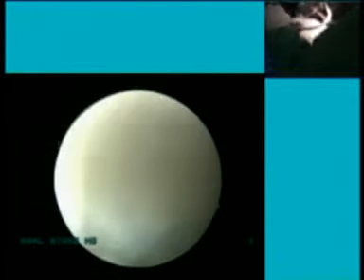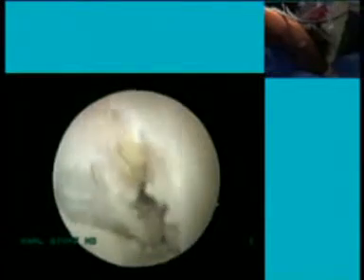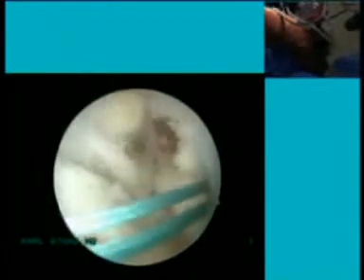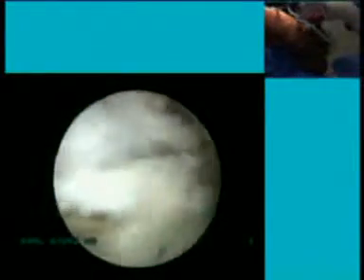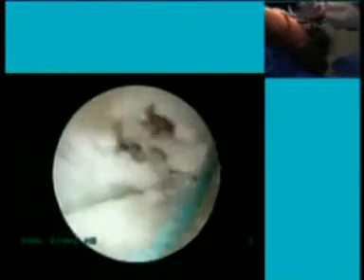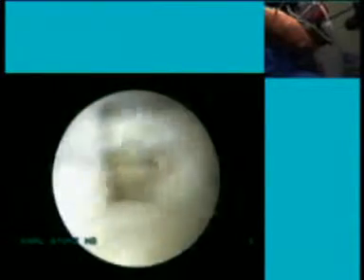These two failures were actually partial failures, so the PL bundle was in good shape. So I just revised the PL. The AM was okay and the patient was having some pivot and the PL was not working. So I got an opportunity to revise two of my own patients. Probably the reason was, we did a CT study of these footprints post-op and both PLs were placed higher. Even now there is still a tendency to make the PL a little higher than its actual position, even with these jigs. So things are still not perfect and we still have to keep making efforts to make it more and more accurate.